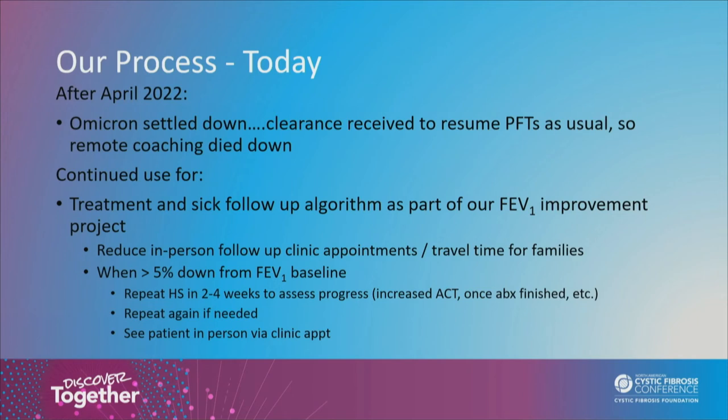We define the patient's FEV1 baseline as the highest within a rolling year, and there's a couple exceptions to that. Like if they're hospitalized, that hospitalization will trump any other FEV1 that they had, since a hospitalization represents the ideal kind of form of health. They're stuck with us, they've had quality airway clearance, they've had IV antibiotics, nutrition is optimized. So we use it for the sick follow-ups in comparison to their baseline, again, with the goal of trying to reduce in-person appointments and travel time.